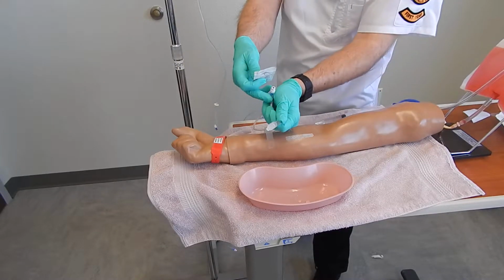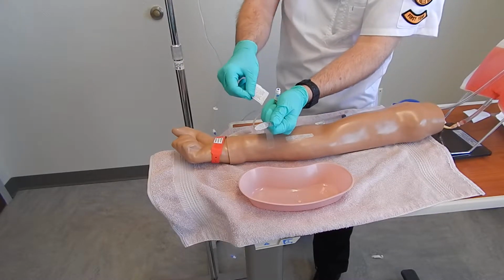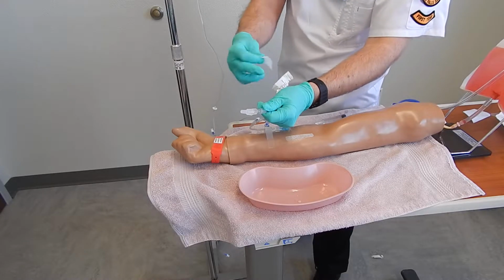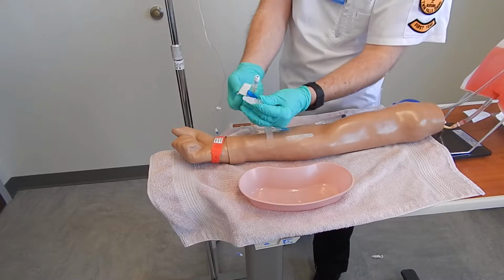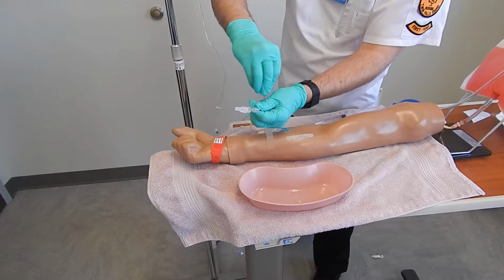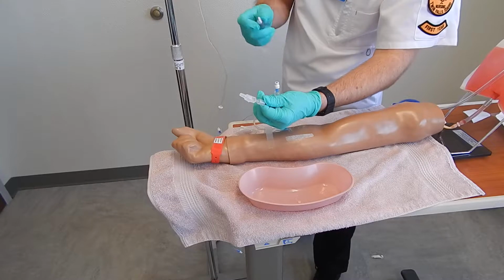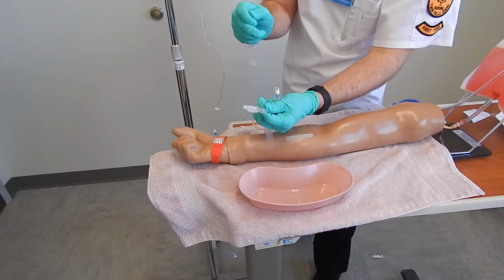I have another alcohol wipe here. Open that up. I want to clean off this port here. Got a flush.